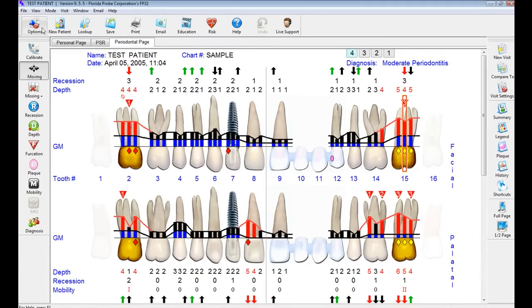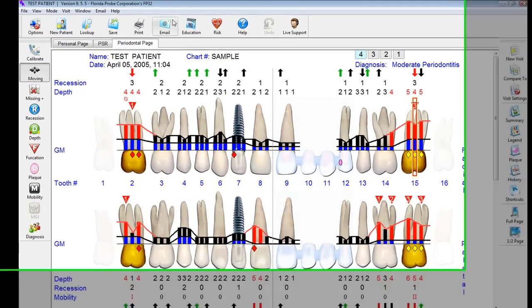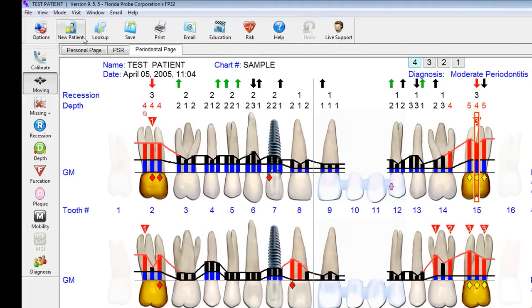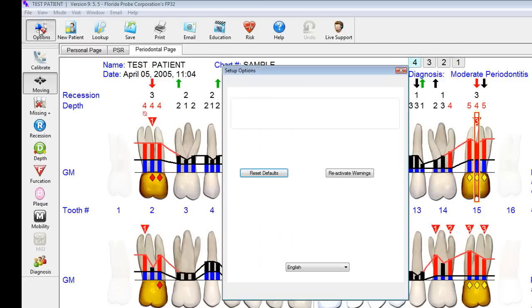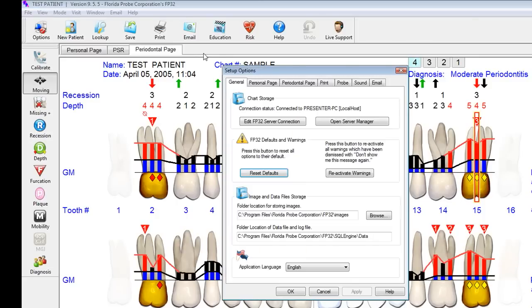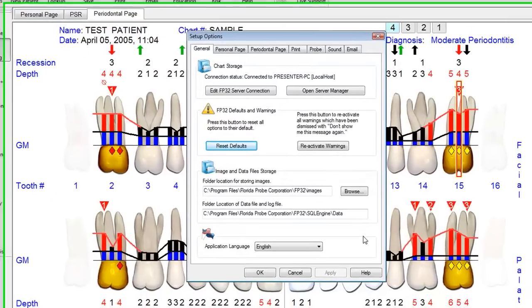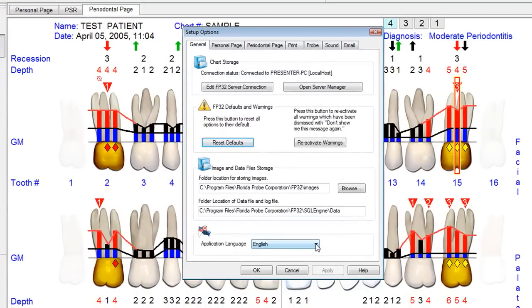At the top of the screen, we're going to see some other options. We have the Options menu where you can fine-tune the software to be quite specific for your practice. We have a variety of different languages to control the entire software package — English, Spanish, Portuguese, and German.